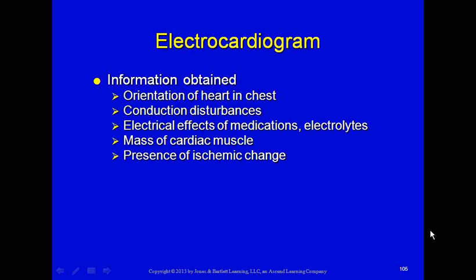And again, looking at the heart monitor, we can determine the electrical effects that perhaps medications have on the heart, but more importantly, electrolytes. We can look at a heart monitor and know whether or not a person's potassium is too low or too high.